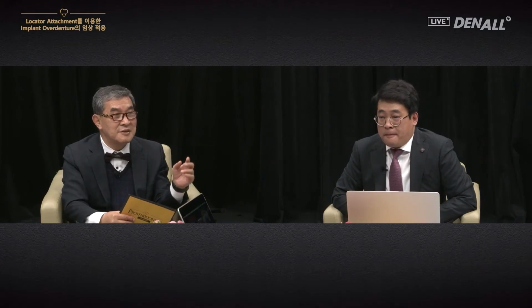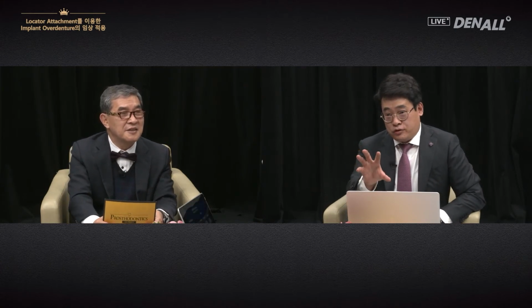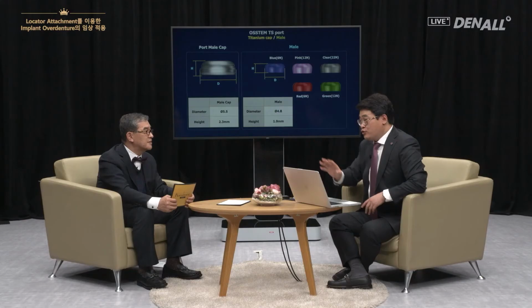The retentive force differs depending on color. Which do you use first? Or do you use the weakest one so that the patient can take it in and take it out easily? Or the middle one? Very nice question. This is the same with TS port. The retentive force differs depending on color.